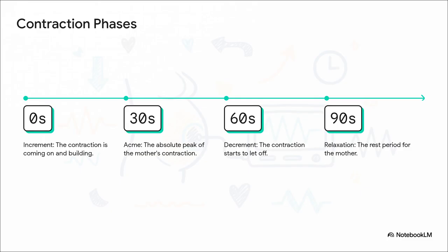Watching this bottom section is huge because it lets us visually assess how frequent and how intense these contractions are. And that sets the whole stage for how the baby's going to react.